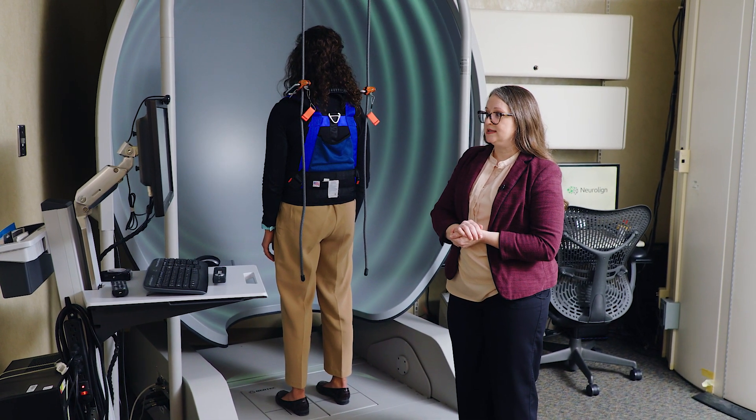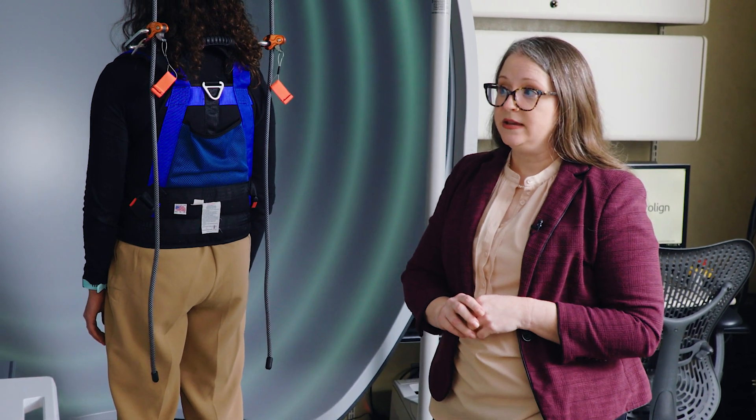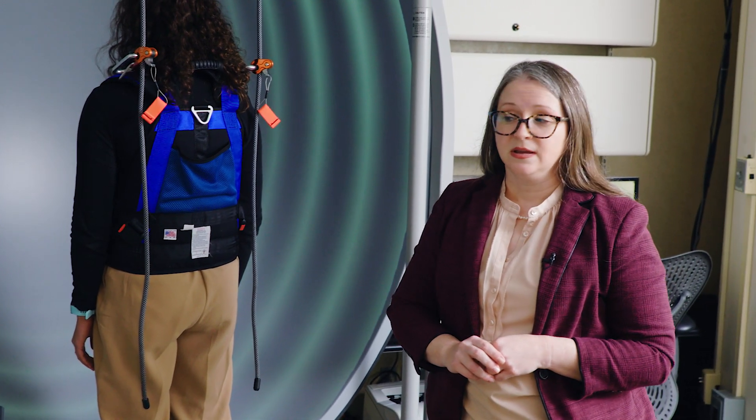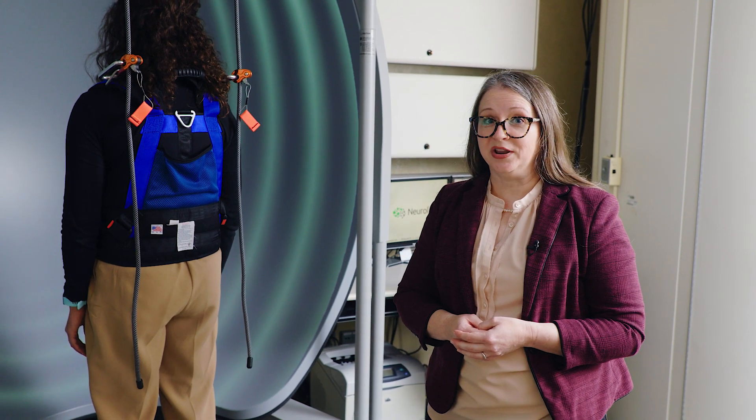Her job is to keep everything as still as possible. It's very common for you to feel unsteady, uneasy, maybe a little bit nauseous. We expect that that's going to happen in most patients, even for those who have normal balance function and no sense of dizziness. This is a very unnerving sort of test — it's meant to make you feel uneasy, and I think it does a pretty good job.